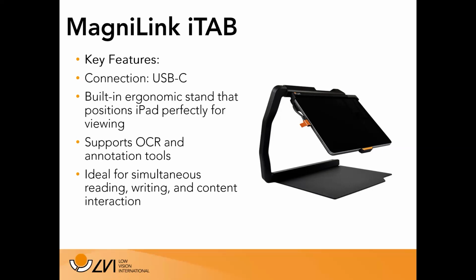So the stand is a good idea for people who like that simultaneous ability to read something, maybe lift that iPad up and write underneath the iPad camera, and then maybe be simultaneously recording a lecture or doing something at distance.